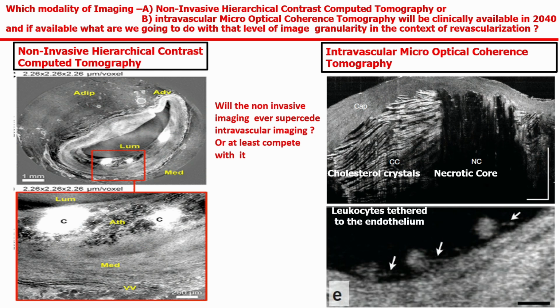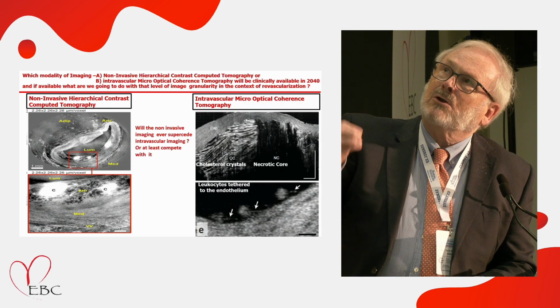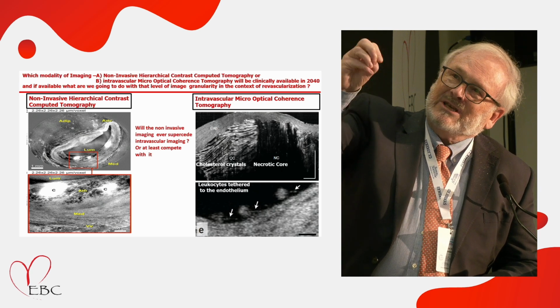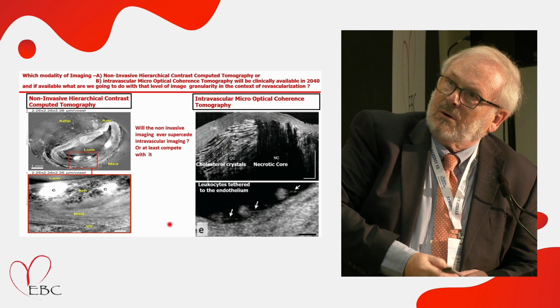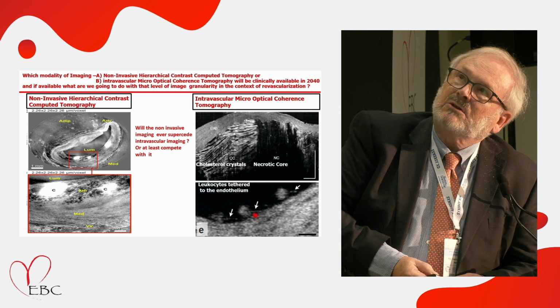On the left-hand side, that's the non-invasive hierarchical contrast computed tomography. And on the right-hand side is the work of Gary Tearney with intravascular micro-optical coherence tomography, published in Nature already a few years ago. And you could see crystal of cholesterol. You see the cap, crystal of cholesterol, and then the necrotic core. And you can even see leukocyte attached to the endothelium.